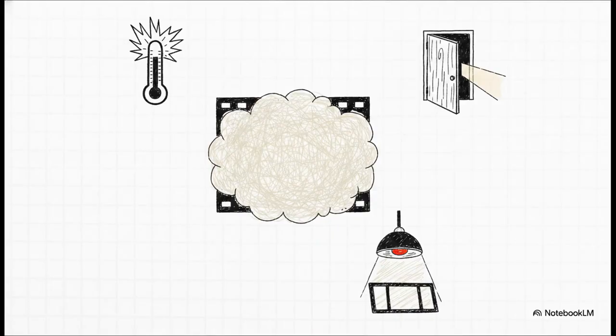Then there's radiographic fog. Fog is basically this super annoying, unwanted gray density that completely kills your contrast, and the causes for it are literally everywhere. If your storage room is hotter than 68 degrees Fahrenheit, fog. If your humidity is outside that sweet spot of 30 to 50%, fog. It can happen from light sneaking into your darkroom, a safe light sitting a little too close to the counter, or simply leaving the film in the developer for too long.